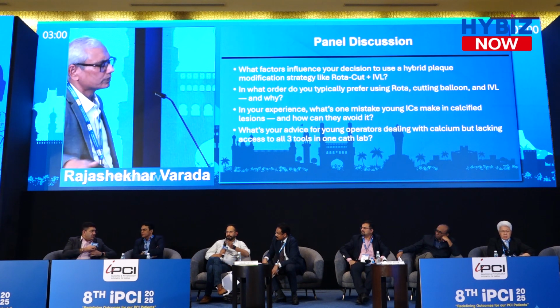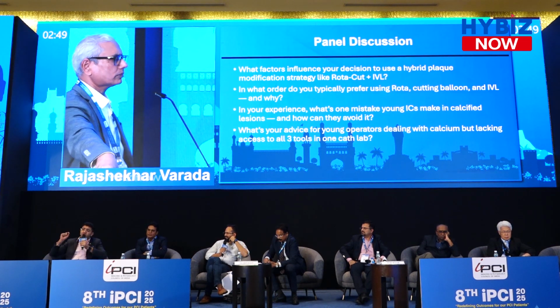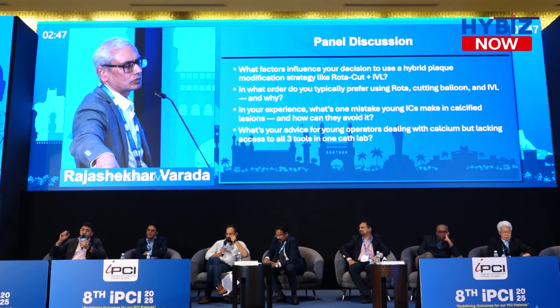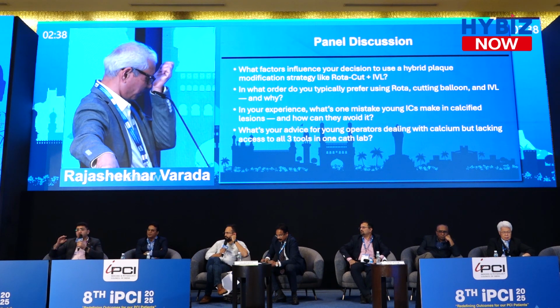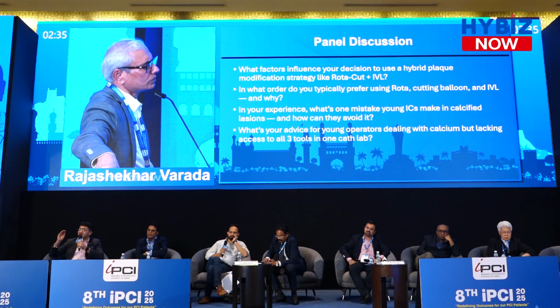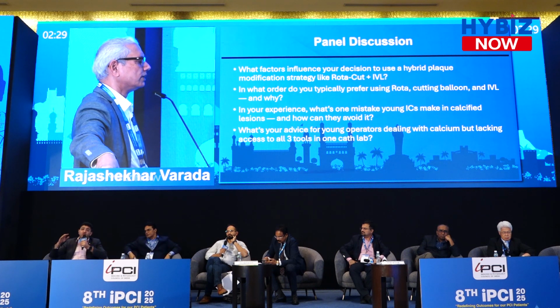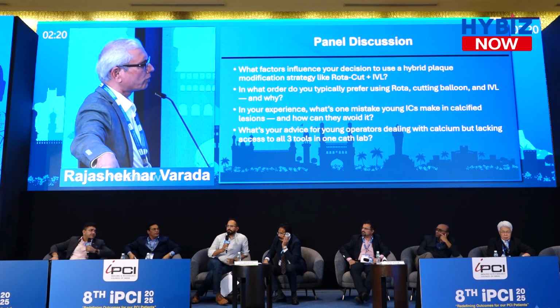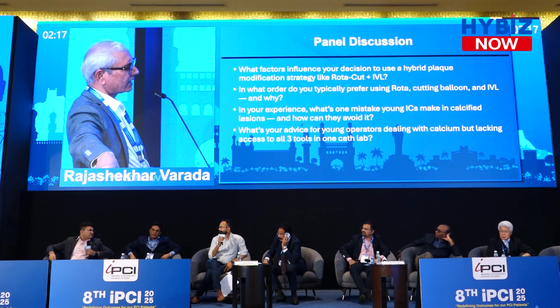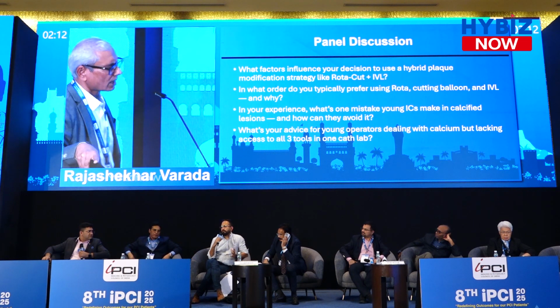So again for fellows, before putting a stent in the left main, you should know the expansion of your stent. Because in my opinion, this left main was close to 4.5, 5. So we should always know whether your 2.75 can go up to 5. I don't think any 2.75 can go that far, because in IVUS we may not see the stent fracture. The Nagomi 2.75 goes up to 4.5. The reason we chose Nagomi was because of that. Nagomi specifically goes up to 4.5.